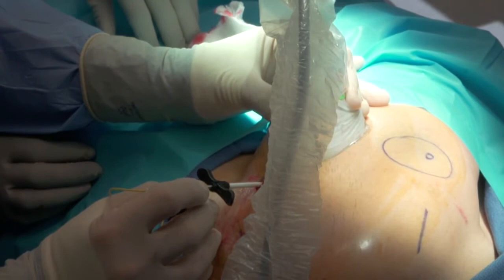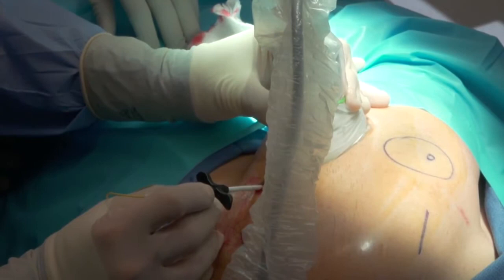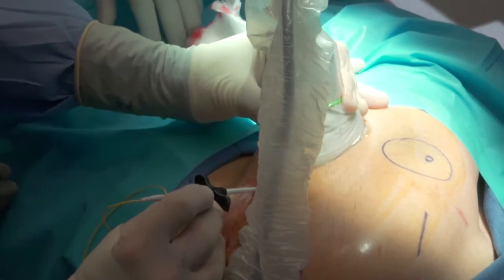There you go. I'm advancing a little more. I can see it under the ultrasound. It's got a nice placement. I feel his arm moving. If you feel it, we're in the right place. I do, I feel it. Okay. All right, Mike, pull that off of there. Yep, pull the white off.